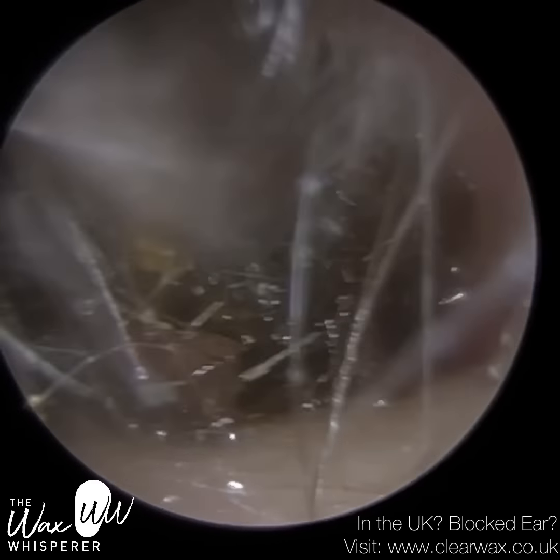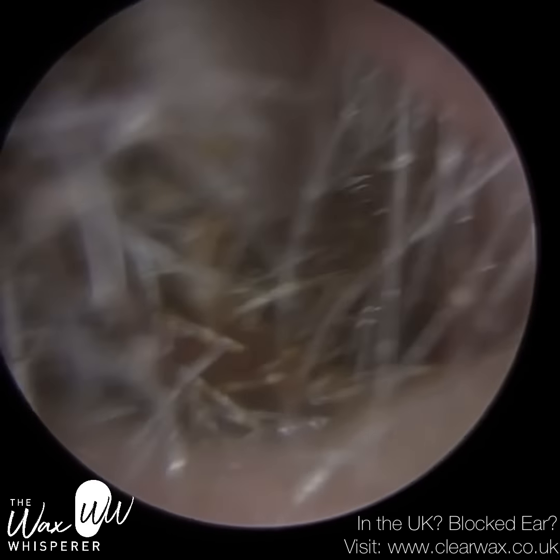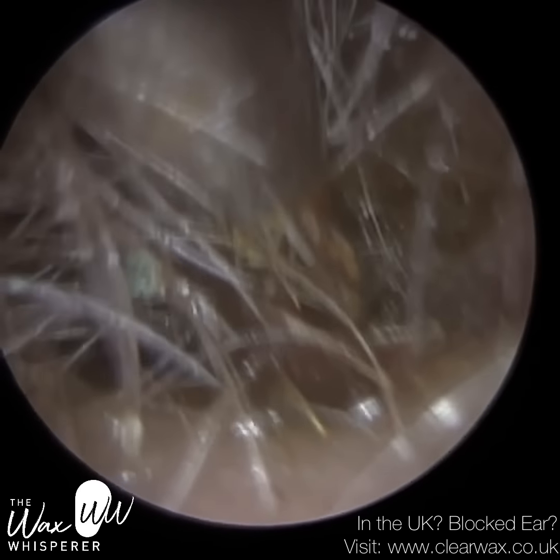So I've just put a hint of olive oil spray in there just to loosen this plug of wax. And you can see that's really helped me to bring it forward. We're just at the entrance now, and it's just got trapped.